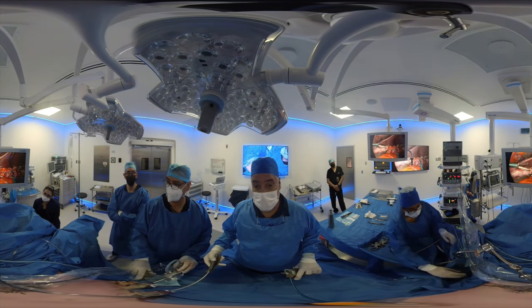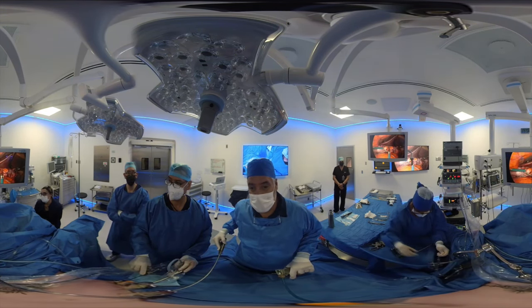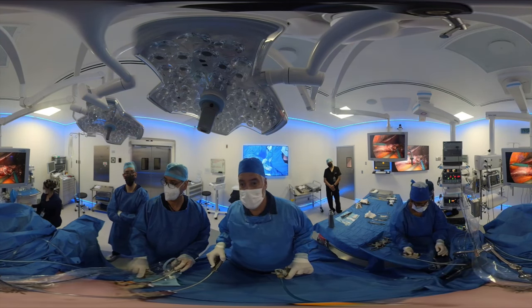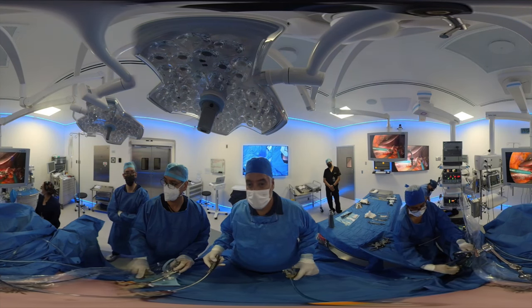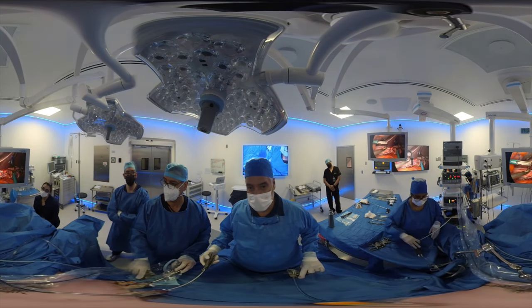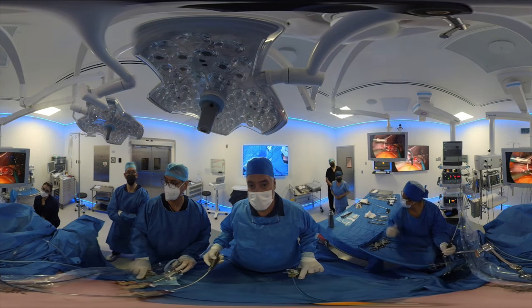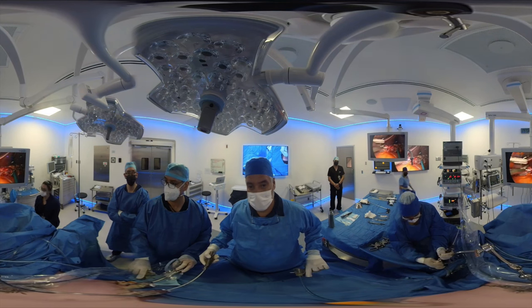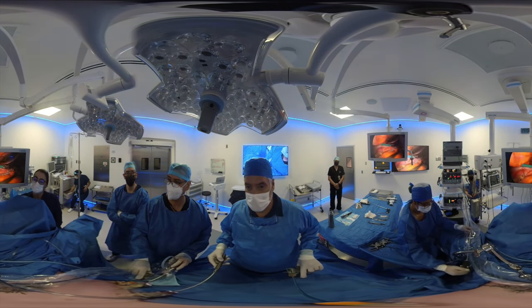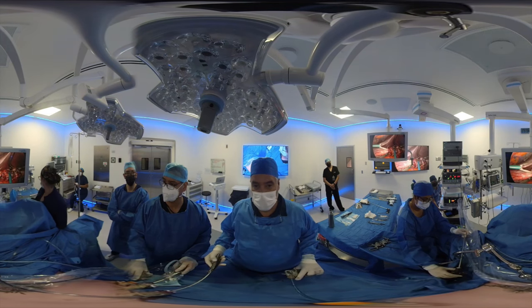We are finishing this over-suturing, which is an OCC exclusive called the double buttress technique. This technique was developed years ago because it prevents staple line bleeding, reinforces the staple line to prevent leaks, and makes for a durable procedure. It also micro-calibrates the procedure, meaning the procedure is fine-tuned and adjusted for weight loss. That's why we trademarked the technique, and this is why we call this the improved gastric sleeve. We're now progressing distally — you can see my anesthesiologist removing the calibration tube partially.